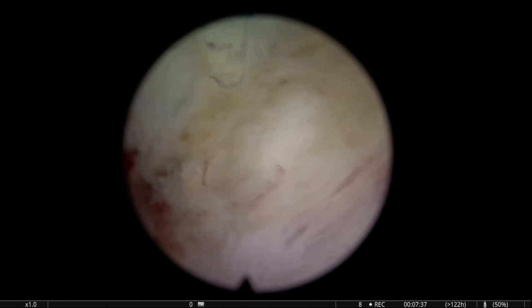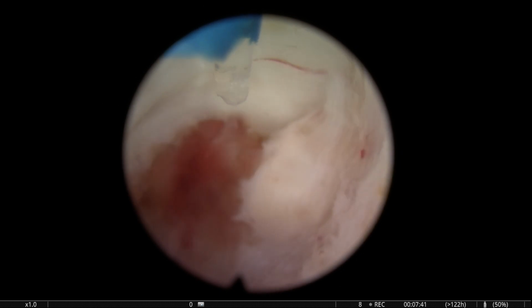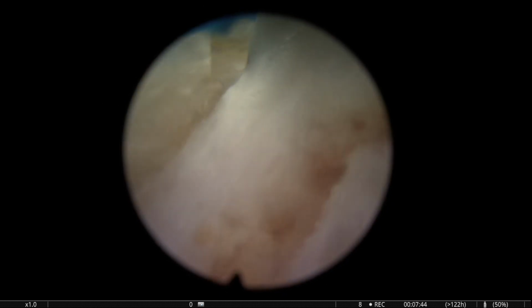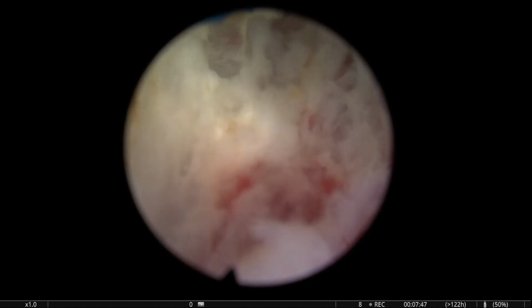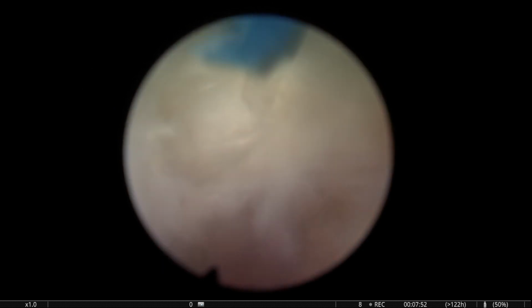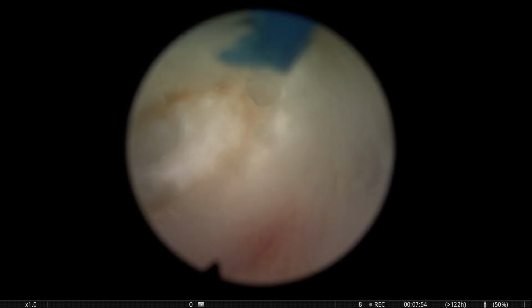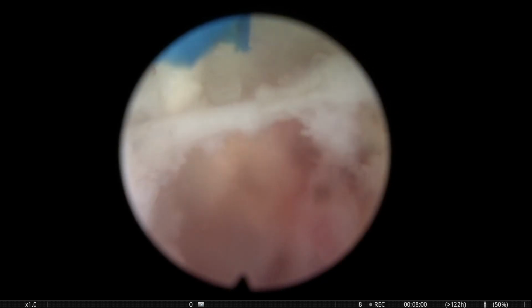Of course, I follow the steps of the operation. We always cut the apical attachments first, because if you try to go up, having the scope inside, you might be putting traction on the sphincter. So here, you see, here I was not very convinced that this was a good plane. But still, I was trying to do a relatively organized line.